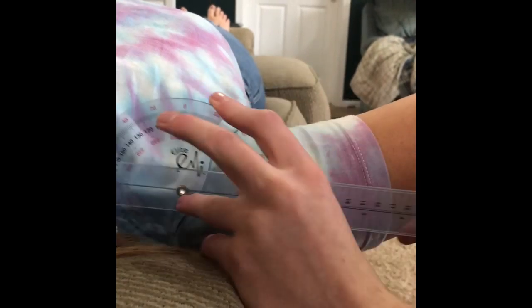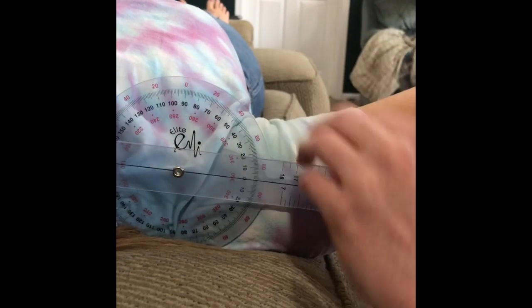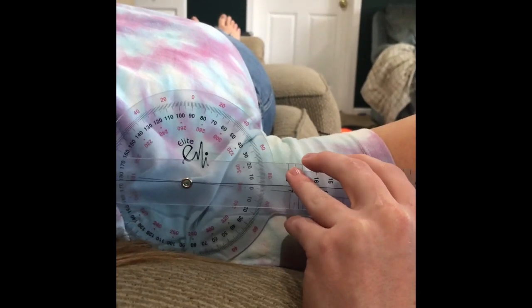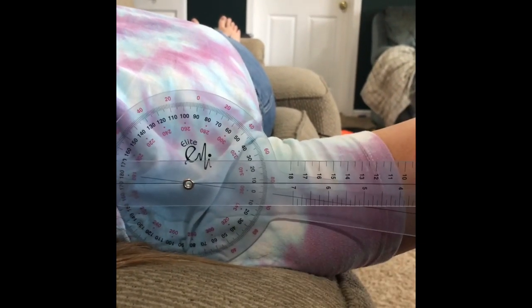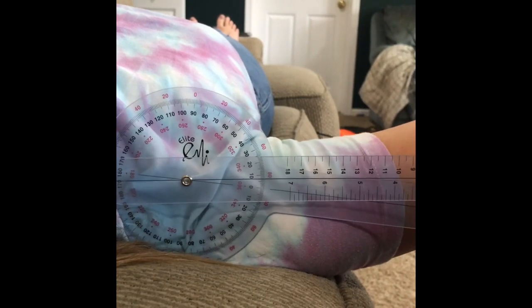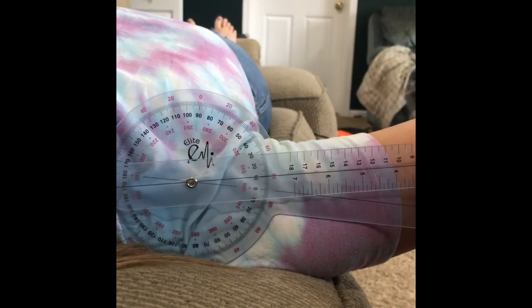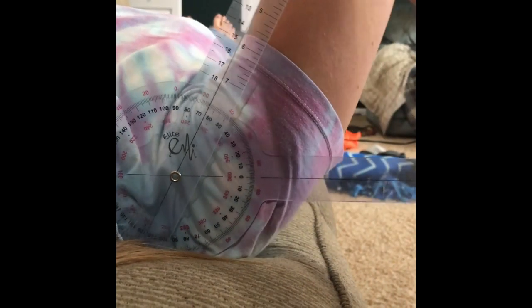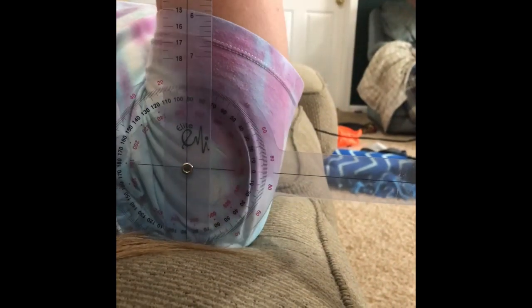All right, now we're going to be measuring horizontal abduction of the shoulder girdle. So in order to do this, you place your goniometer at the axis of rotation of the shoulder joint, have your stationary arm be parallel with the floor, and have your movement arm be parallel using the bony landmark of your humerus. And then when the patient is ready, you would have them move slowly upwards until you start to notice that the patient is recruiting their other muscles in order to assist them, right about there.